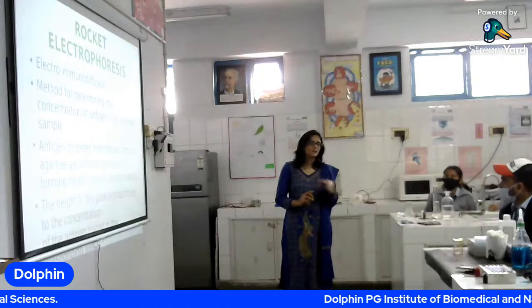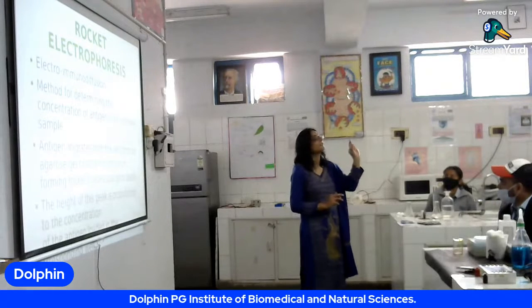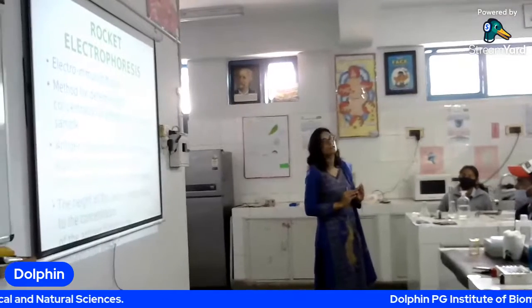So when sample is there, we will be able to quantify it. और थोड़ा सा amount भी है, even which is in the micrograms. Even then वो antigen भी जो है इस test से हम detect कर सकते हैं. So that's why it is sensitive now.